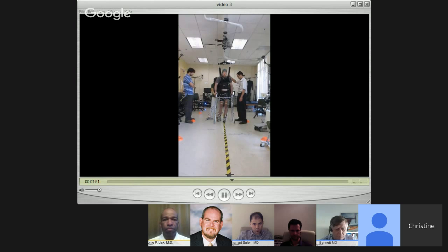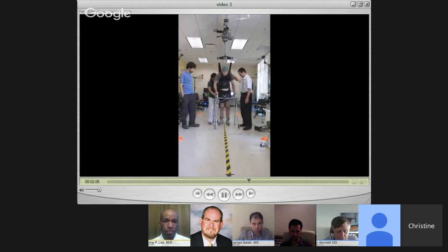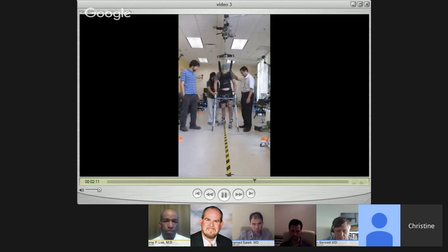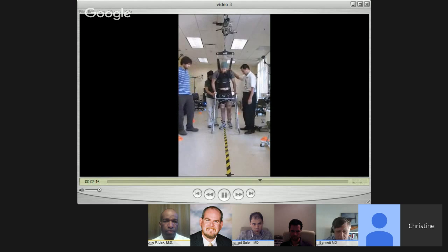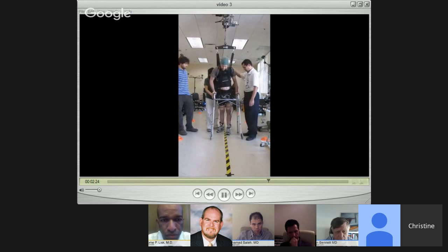What is great about our BCI system is not only was he able to do this with textual cues as well as verbal cues, but he was also able to hold a light conversation while performing this. Again, this shows that we are really able to filter out just your walking versus not walking electrophysiological signals. Other signals, like using your arms to keep yourself posturally stable, as well as maybe speaking or visual cues, do not seem to conflict with the device, and he's still able to maintain a good level of control.